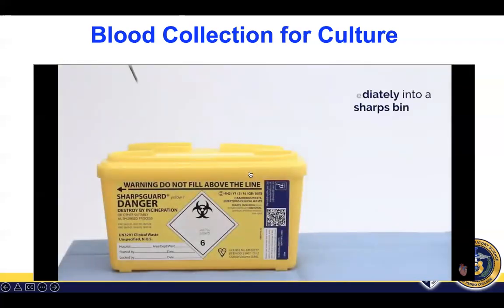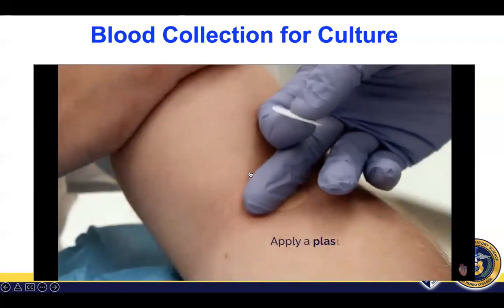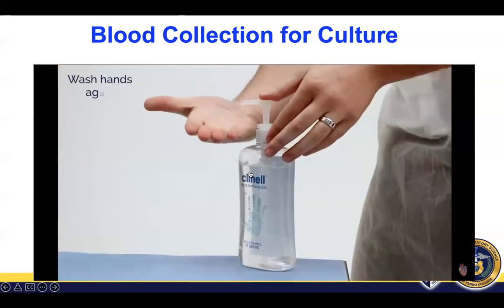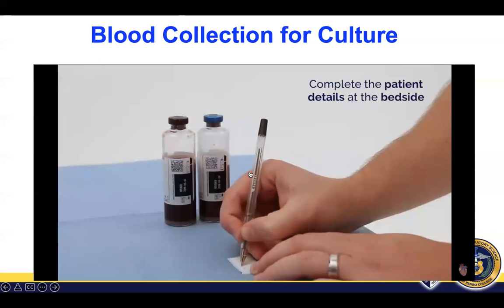Nice. Remember to dispose your sharps in the sharps bin. And of course, patient care. Do not forget to disinfect after handling.